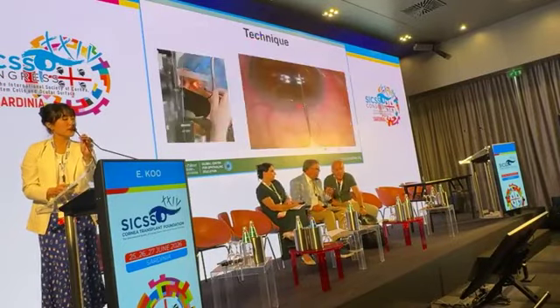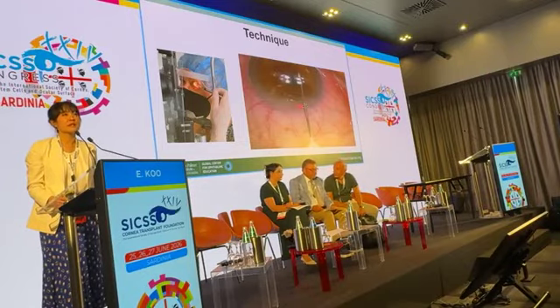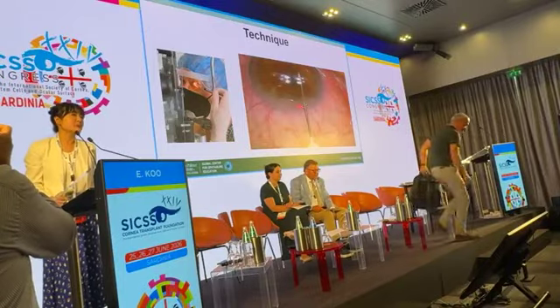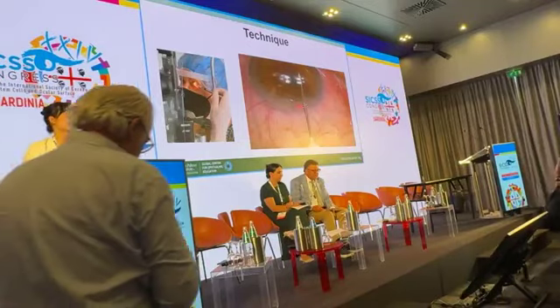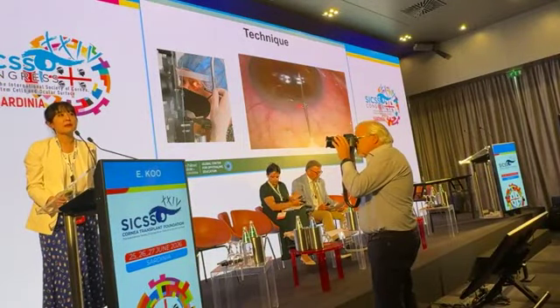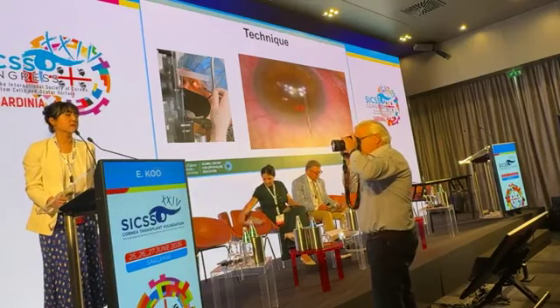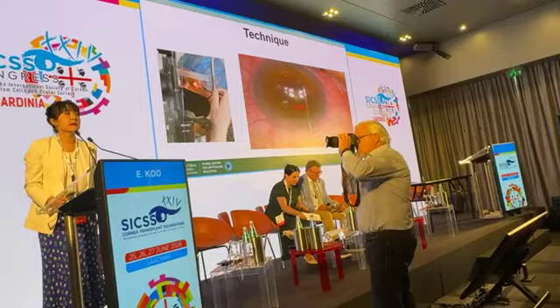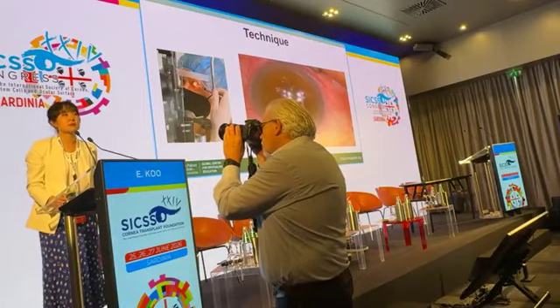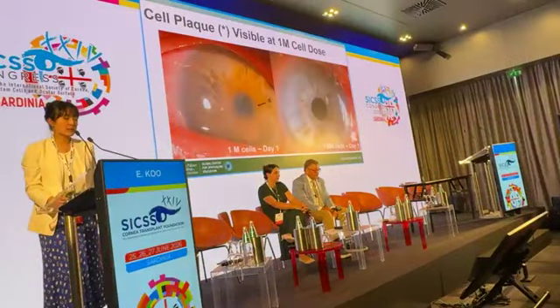Okay, so I think the promise of endothelial cell therapy is that we are able to treat patients with endothelial dystrophy and dysfunction in a different way. The real promise of this therapy is that we may be able to address the corneal donor tissue shortage around the world. And also the advantage of this therapy is that we can circumvent the need for an operating room potentially, because this is something we can do either at the slit lamp in the office, or this is a patient of mine that I injected in our LASIK suite. So this is something accessible to all and hopefully decreases the barrier to care for a lot of our patients.